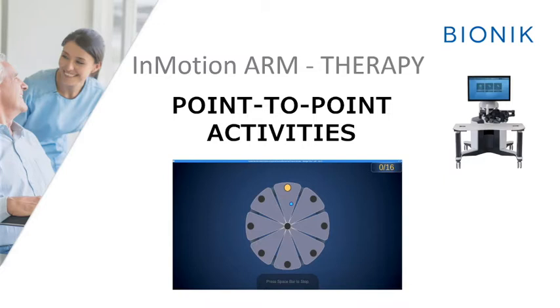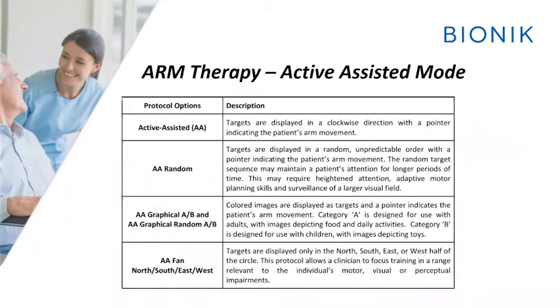Some of the options for arm therapy are listed here. The device allows for a wide range of activities, including movement focused on improving range of motion, strength, coordination, directional movement to isolate motor directions and deficits, and two modes of increasing focus and motor coordination called error augmentation and curl perturbation.